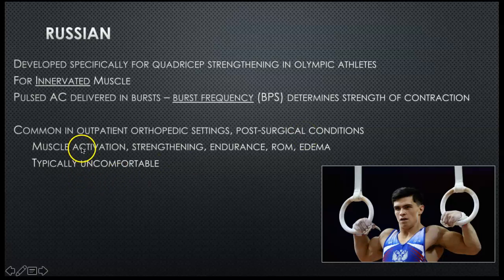And it can be used for muscle activation. Let's say somebody after surgery, they can't really figure out how to contract their muscle. So we use this to kind of re-educate it. So neuromuscular re-education. It might be used to assist in strengthening.